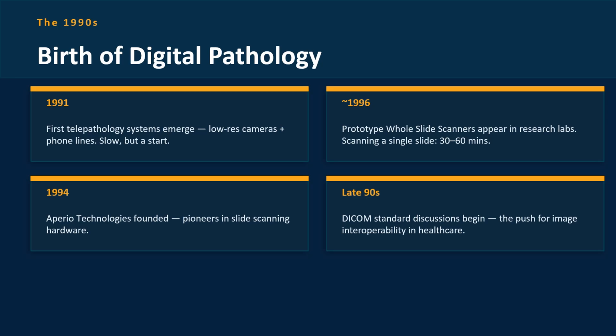However, there was one problem. Scanning a single slide would take 30 to 60 minutes. Obviously not apt for high volume centers. Then in the late 90s, DICOM discussions began because hospitals needed a common way for medical images to move between different machines and systems. The goal was pretty simple. A CT, an MRI, pathology, or radiology image should not be locked inside one vendor's software. The seed was planted, but germination would take another decade.